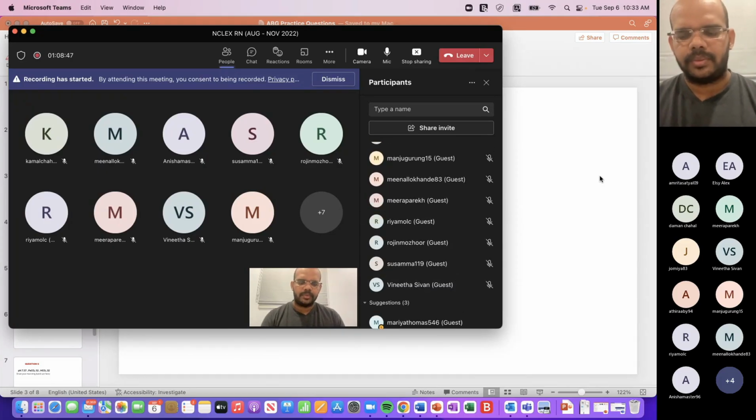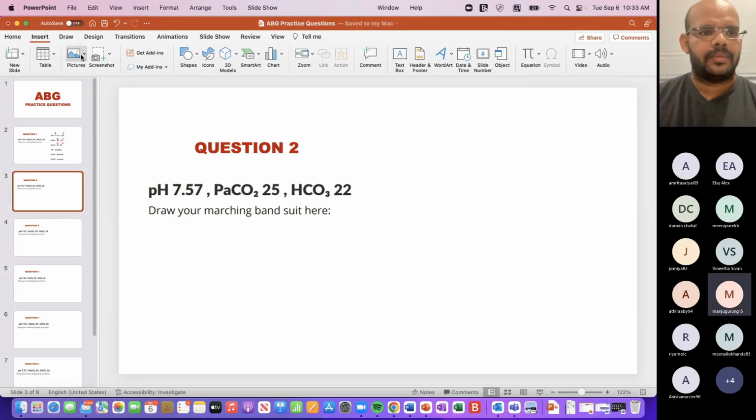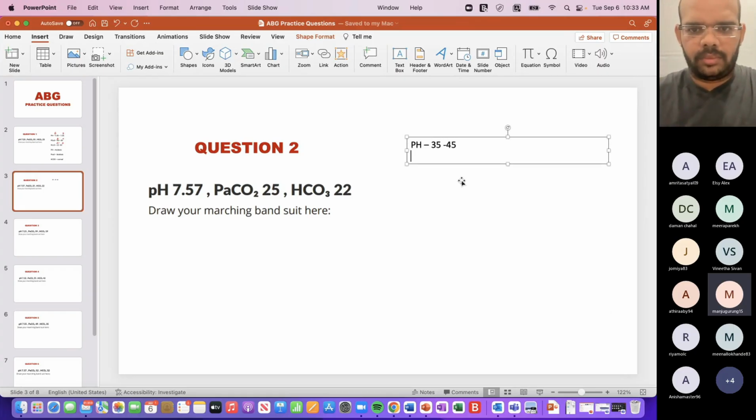Manju, yes, can you go ahead with this question? The pH is 7.57. It's alkalosis. PaCO2 is 25. It's alkalosis.